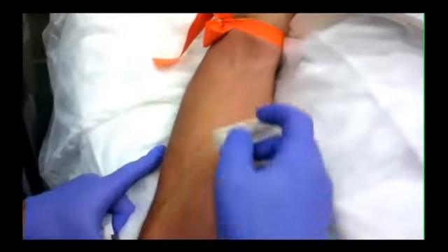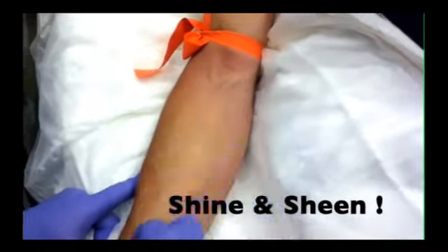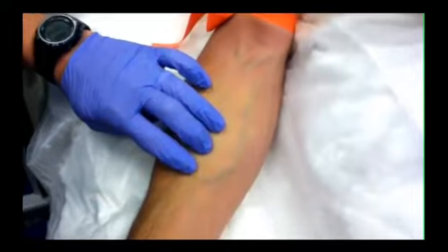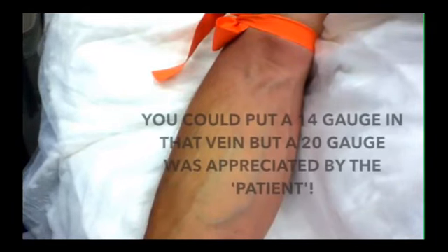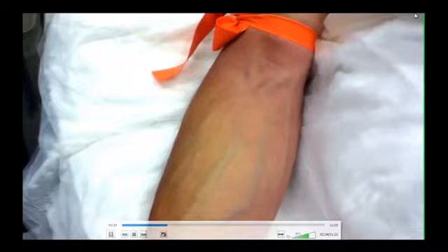Cleaning it — getting some alcohol on top — will allow it to shine and get a sheen on it. We prep this with a 30-second scrub and then about a 15-second dry time. Feeling all the way down, I can feel the vein on top. Putting a little bit of proximal pressure down will also show the vein up even more. IV size is also a factor — if we need a CAT scan, we'll definitely be looking at an 18. For demonstration purposes, we'll just do a 20. Since this is a thinner arm without a lot of subcutaneous tissue over the vein, I can see it very easily, so I won't need an aggressive angle — maybe 10 to 15 degrees.